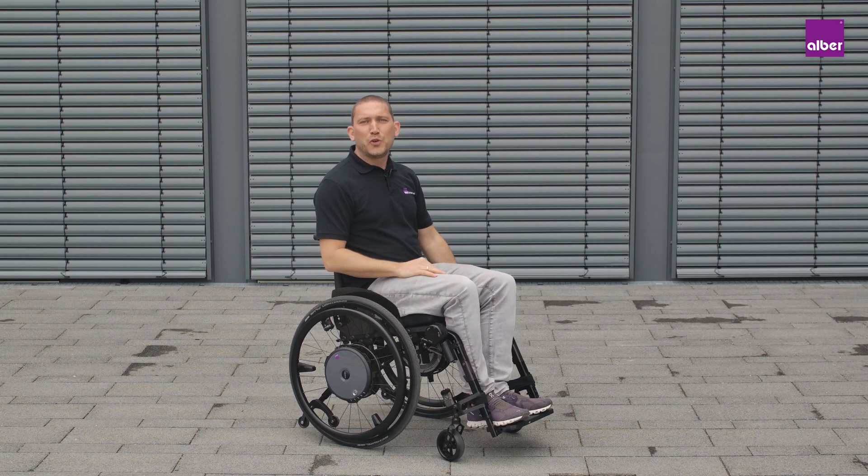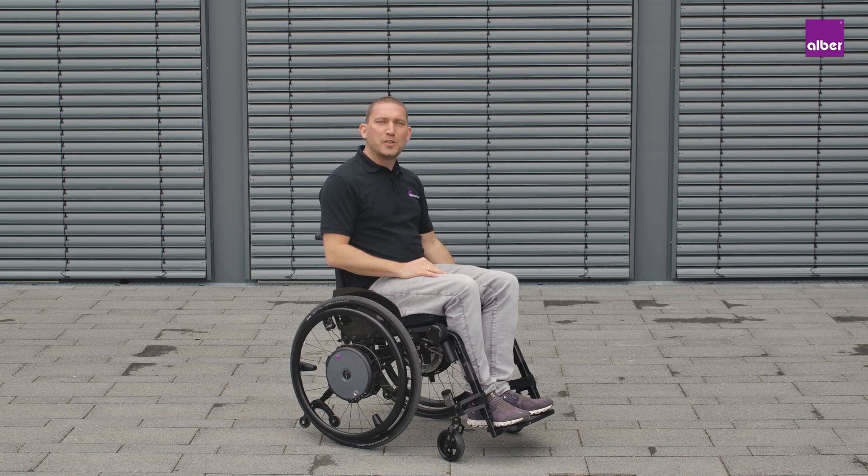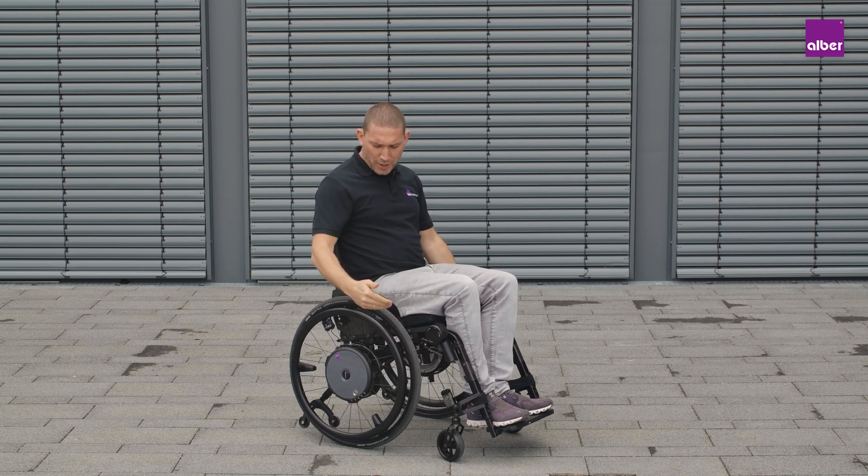Today I'm going to show you the Emotion Duo Drive. The Emotion Duo Drive combines two driving modes in one. You are able to change between power assist over the push rim and instant cruise mode without pushing.